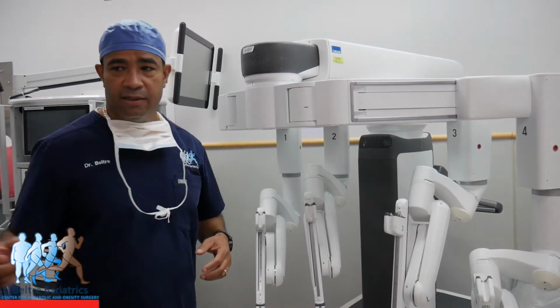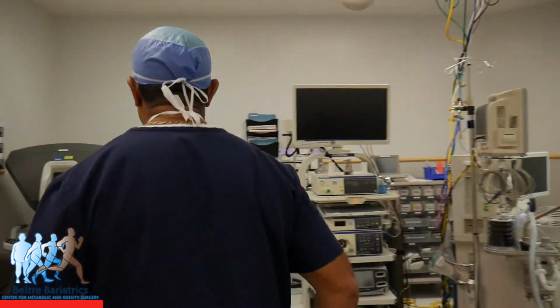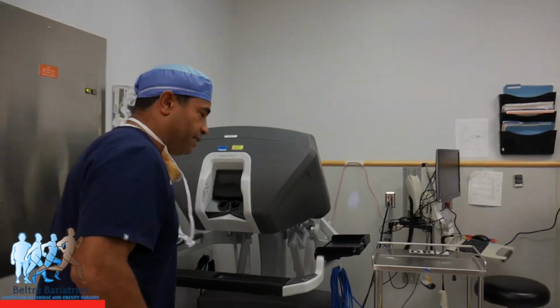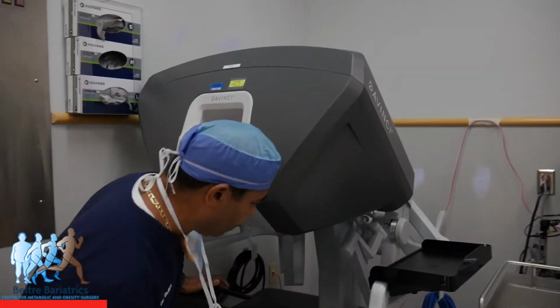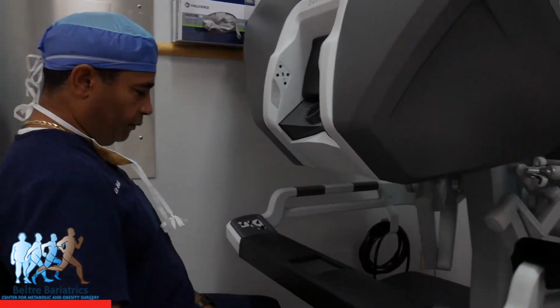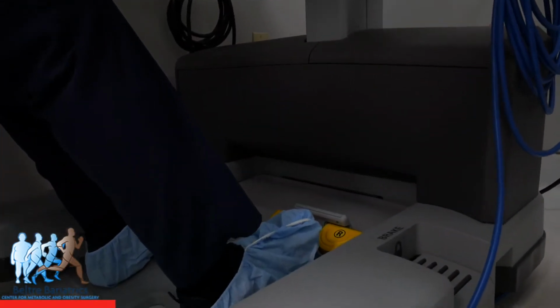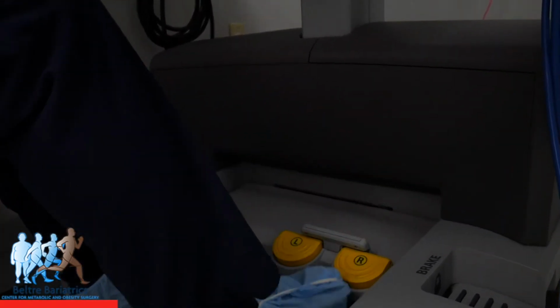I'm going to take you guys over here to the console. This is a robotic console. Right here, I sit in this chair, okay? And there are pedals down here. My feet, I can adjust this to my height. And these pedals operate different things.